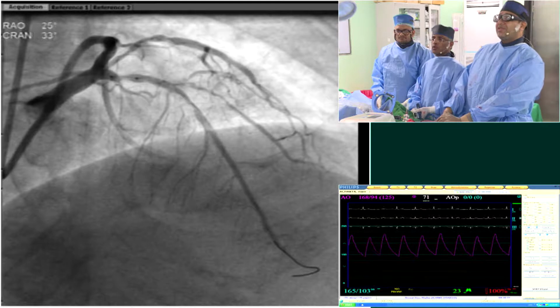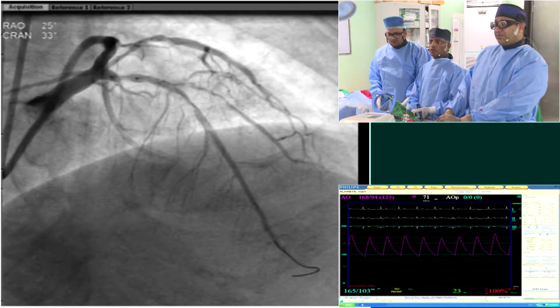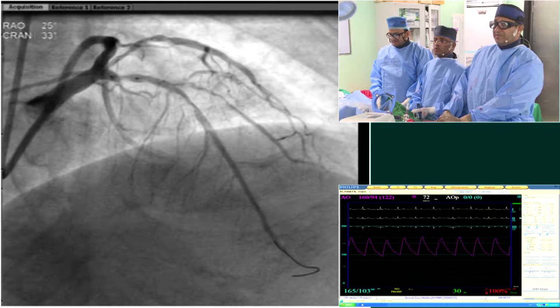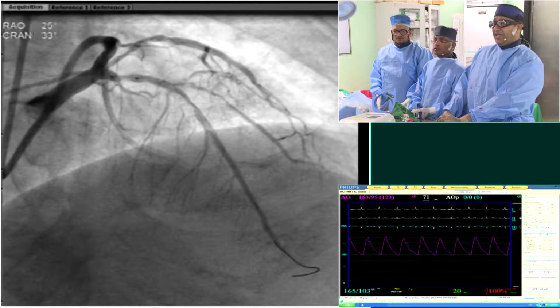Would you not stent? Because I can't get the OCT down to really see now. If your Flextome's not expanding at that high pressure, I doubt your stent will expand. That's true. You'll have a big waist. And that's not worth leaving it at that point.